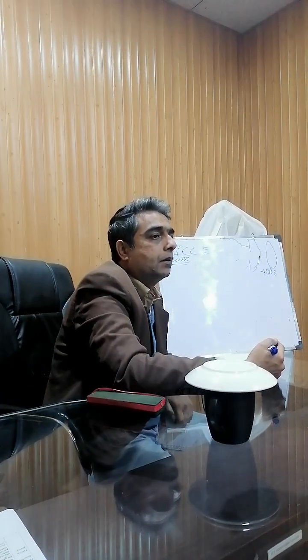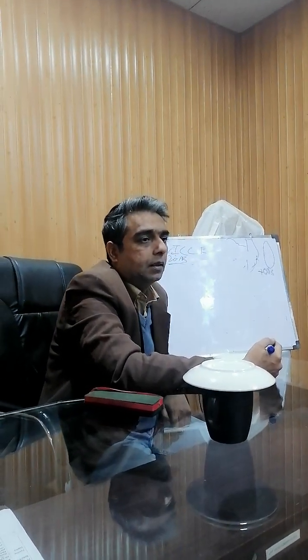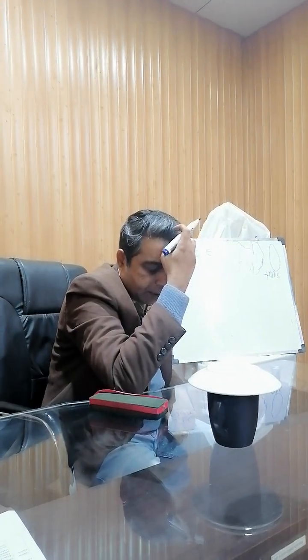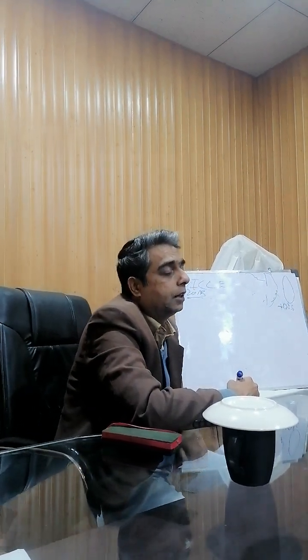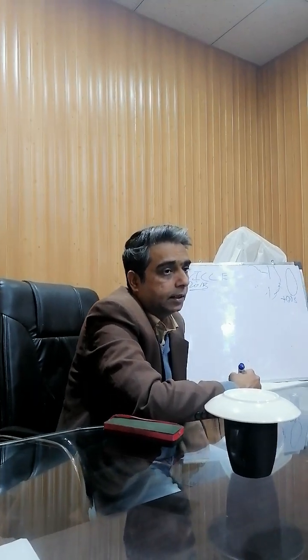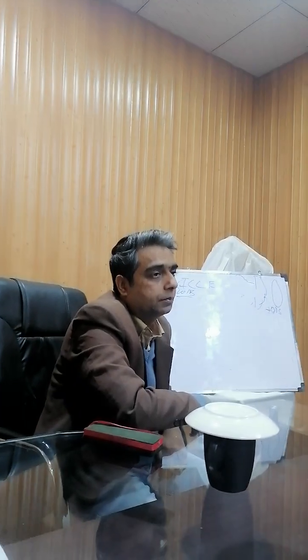But patients and doctors even misunderstood when this started, and they still misunderstand, and they still think that phacoemulsification is a laser surgery. The patient comes to you and asks, will you do my surgery by laser? And we say yes, but what we mean is that we will do it by phaco, but actually phaco is not a laser, it is an ultrasonic probe.